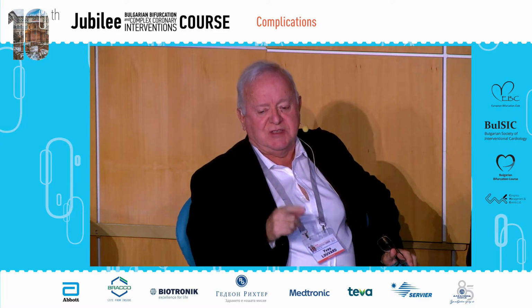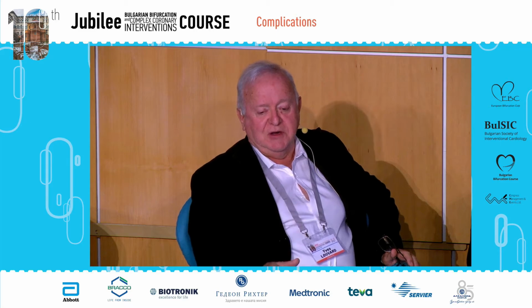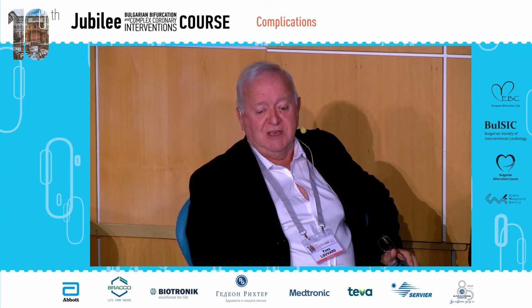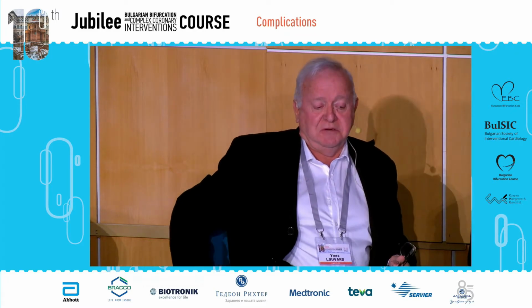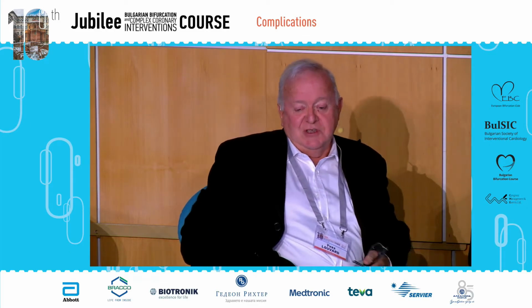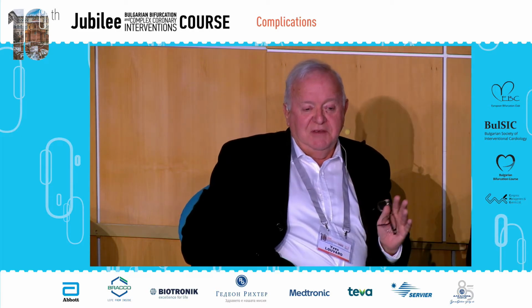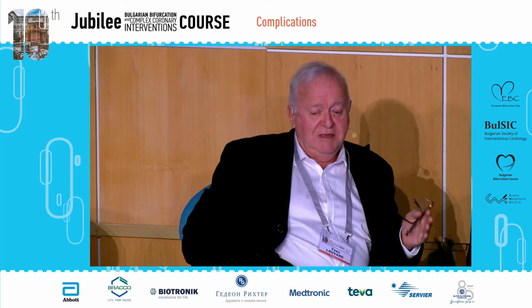I'm not sure that we can choose the position of the stent in this situation using an IVUS, because you have no flow. So, yes, you know where your IVUS is, but you don't know in which part of the artery the IVUS is, really at the millimeter. So I don't think it would bring anything interesting. And of course, this is the right coronary artery, but if you occlude a left main during a coronarography, you don't have time to do IVUS.